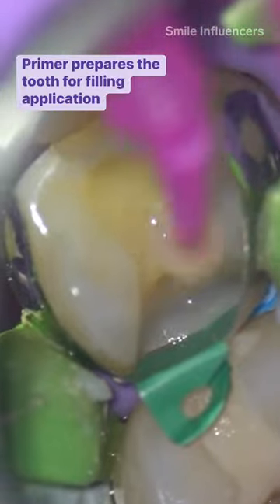I'm using a bonding agent called Clear Fill SE Bond. The primer and bond essentially prepare the tooth surface for the application of our composite resin filling material.